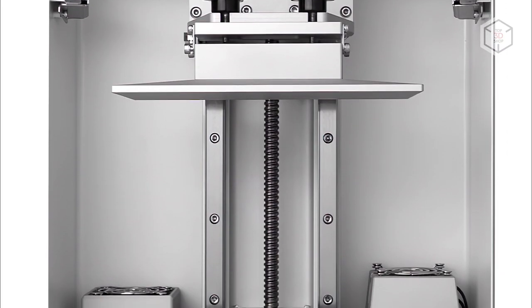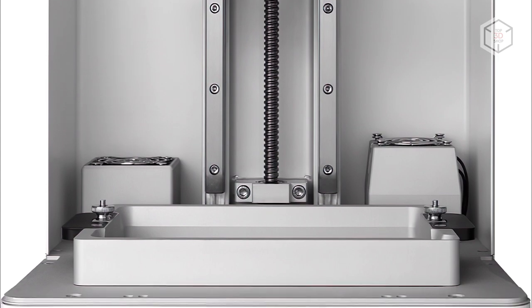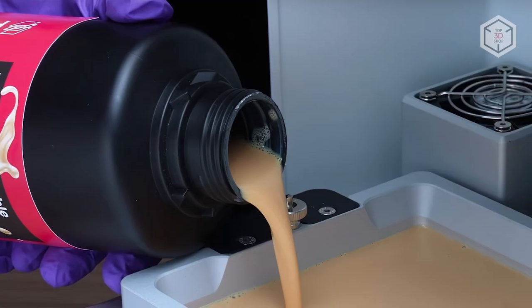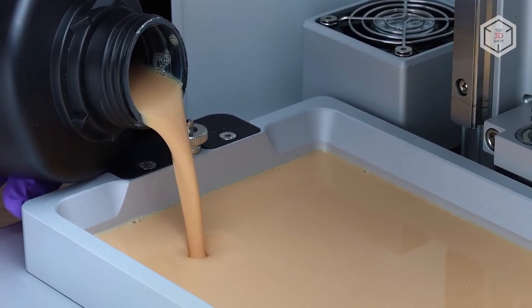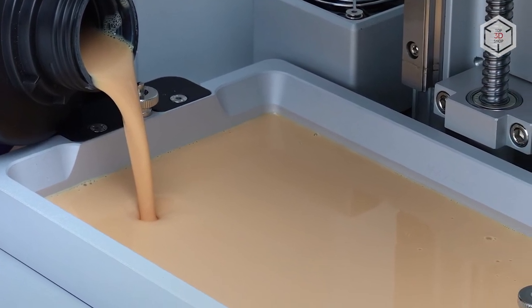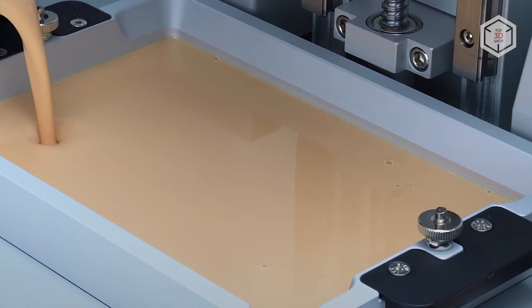Inside of the XL 4K 2022 is where we can find the most recent innovations. The design of the resin vat has been changed to incorporate two plastic handles on the sides, a widening at the top to store more material, and a cutout for draining the resin. Again, this does not particularly affect performance, but makes the machine much more user-friendly.